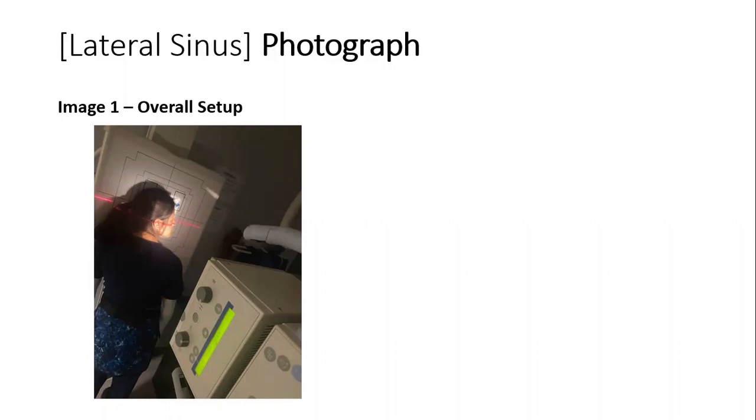period if needed. Our image receptor size for this image should be a 10 by 12-inch cassette. Our image receptor orientation should be portrait mode, and our image receptor location should be at the wall bucky. It could also be done at the table bucky, but the wall bucky would be most preferred. Our SID for this image should be approximately 40 inches or 100 centimeters.